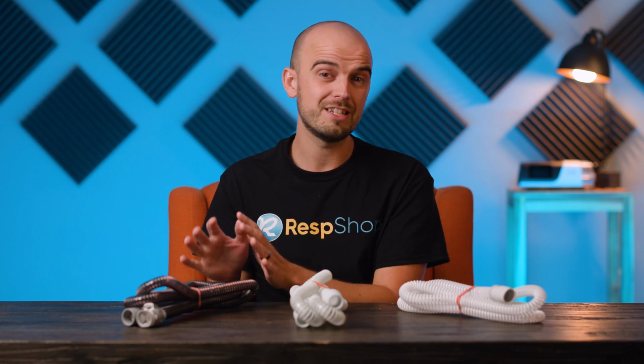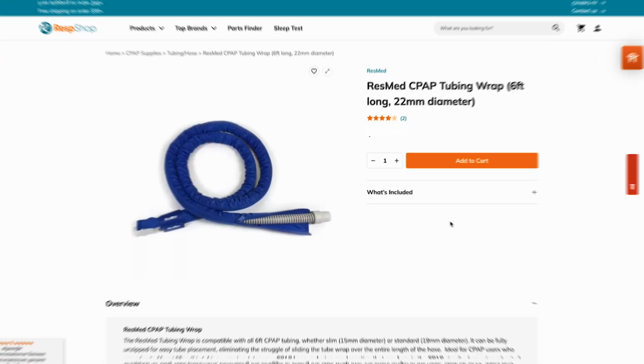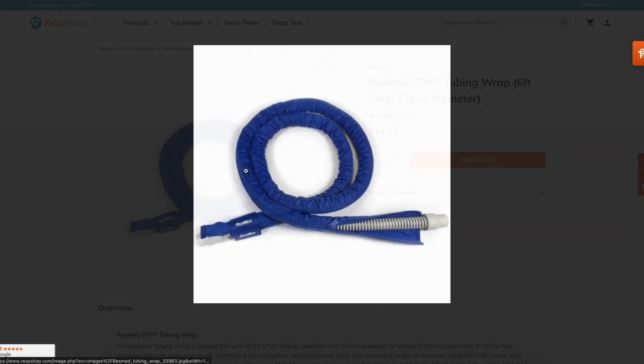But it isn't all benefits. Heated tubing usually is more expensive than non-heated tubing, and the coil makes it heavier and less flexible. And if you are worried about rainout but don't want heated tubing, you can try using a tubing wrap instead. This is basically a fabric sleeve designed to help prevent condensation buildup and to keep the tube from getting dirty and damaged too. It's what they used to use in the old days before they invented fancy heated tubing, and guess what? It actually still works.